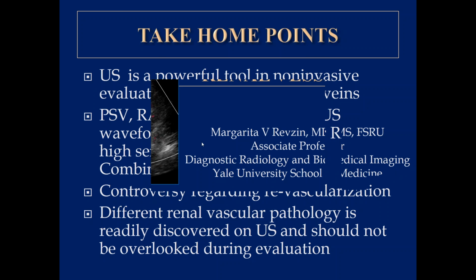It works like magic, especially in those patients who either were not NPO or who are very gaseous. Also, I found that I usually keep patients supine and try not to rotate them, because the kidney is located posteriorly, and if you rotate the patient to a decubitus position, the kidney will descend a little bit and be further away from you, so it's going to decrease the ability to get a Doppler signal from these vessels.